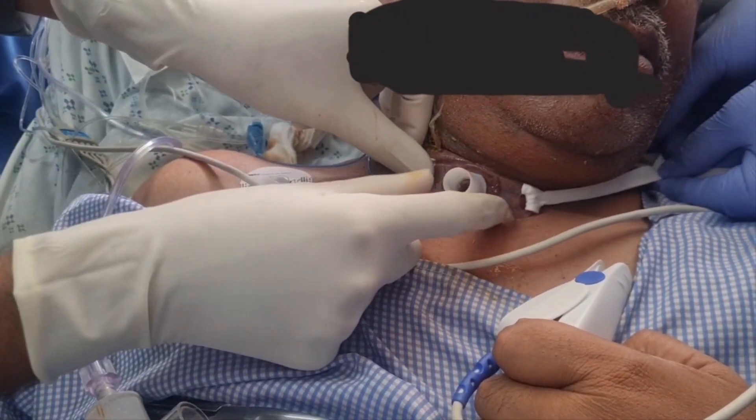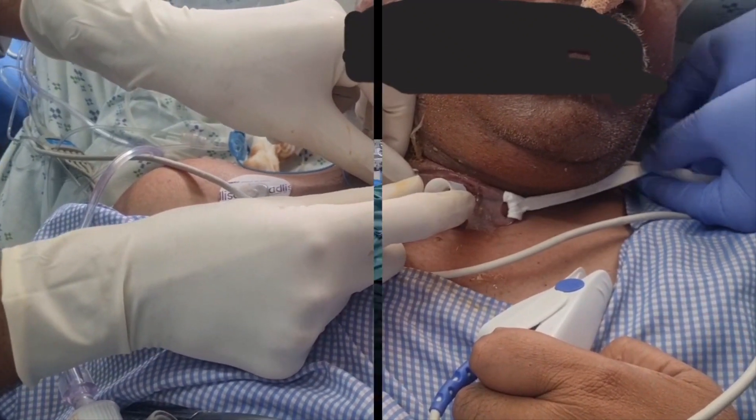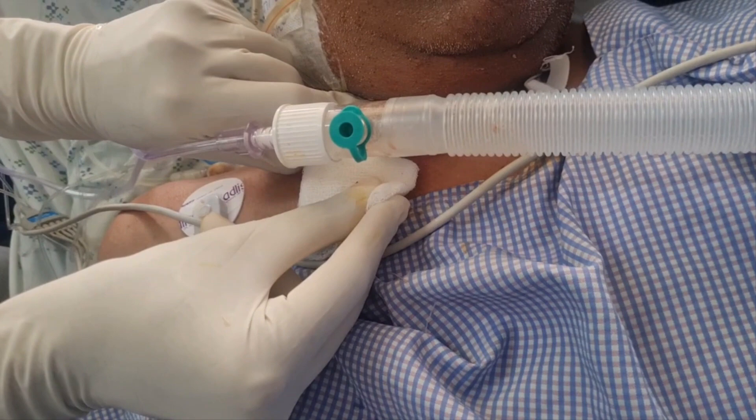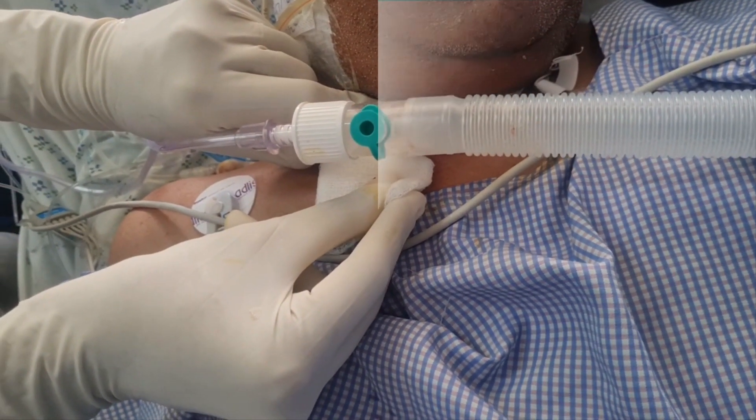While tying the knot, we keep one finger on this side and tell the assistant to tie a very tight knot. Then we do a routine dressing below the flange with povidone iodine solution.